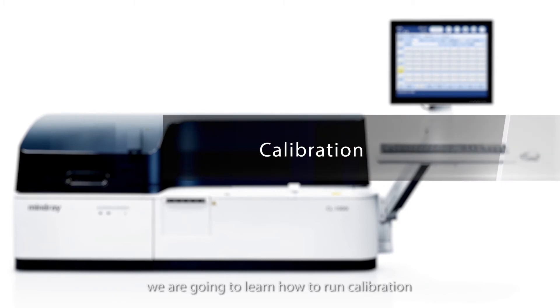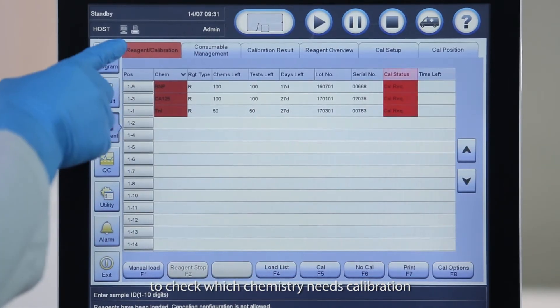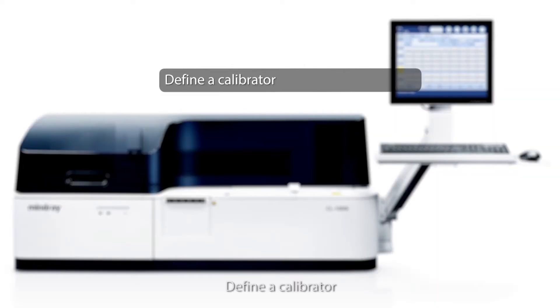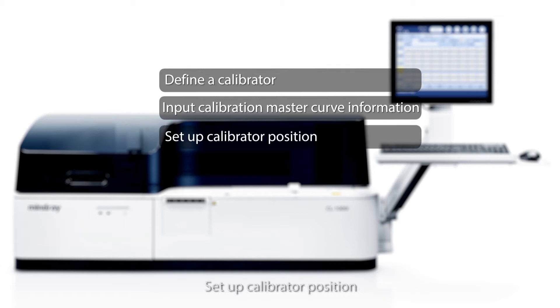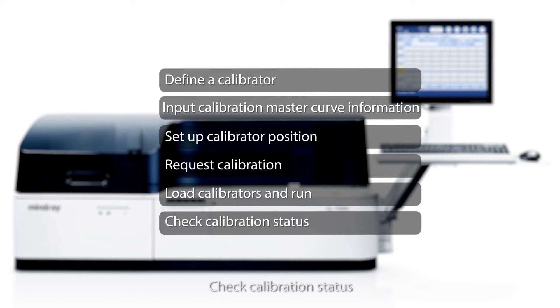Moving on, we are going to learn how to run calibration. You can go to the reagent calibration page to check which chemistry needs calibration. If you run a calibration, you can perform in the following order: define a calibrator, input calibration master curve information, set up calibrator position, request calibration, load calibrators and run, check calibration status.